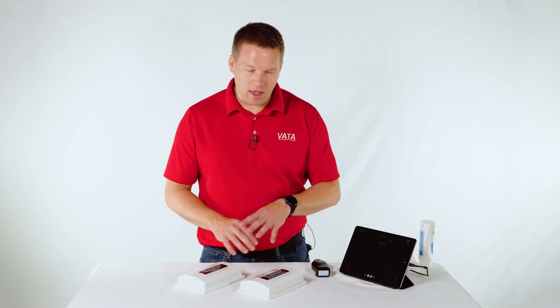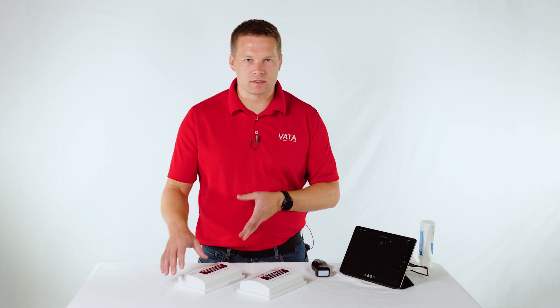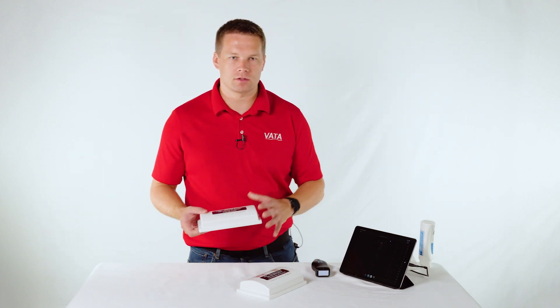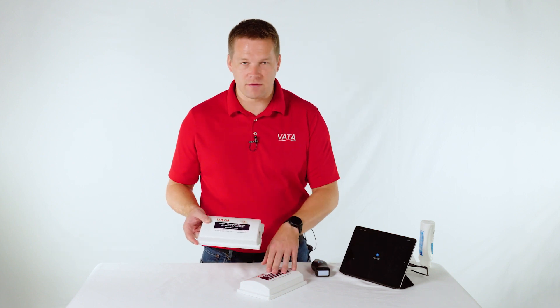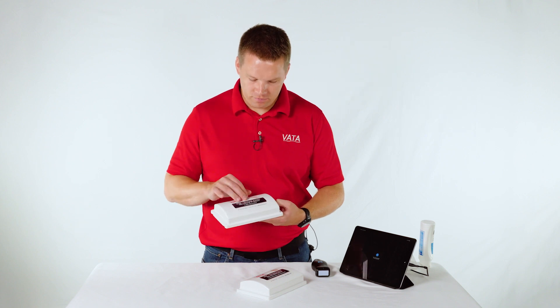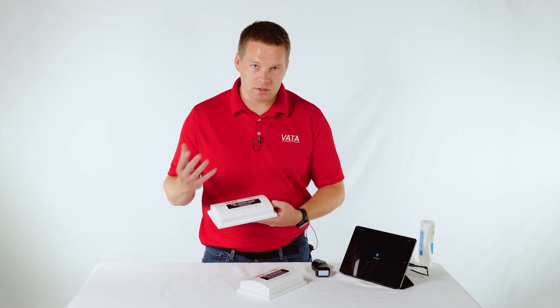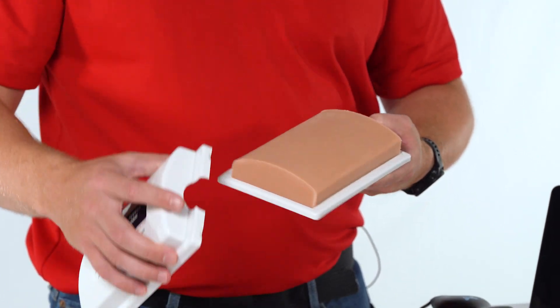We have a few different models. I don't have all of them here, but this is going to be pretty consistent across all of the ultrasound models, at least the ones for vascular access. We have here our 705 and our 707 vascular access phantoms. Both of these are going to be the same material, same everything, with the exception of the vein configuration.